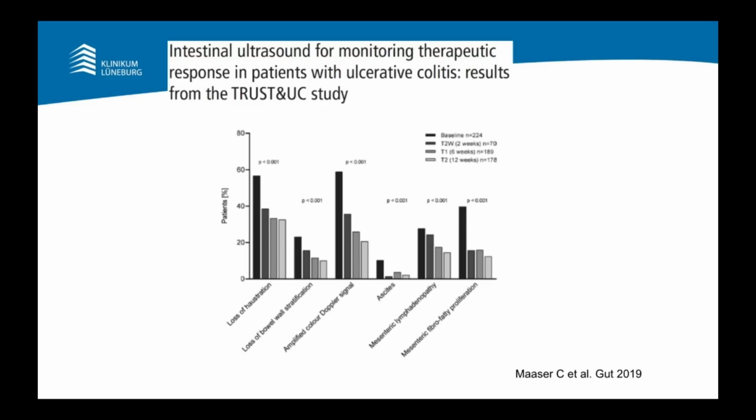So at a very early time point, you can actually follow up patients where you perform anti-inflammatory therapy. You could never do an endoscopic follow-up at 2 weeks or even at 6 weeks, but with ultrasound you can see a very early response. Now future studies will have to detect this, looking at this early time, but you can really predict who is on the right medication, where you have to intensify medication, or where you could maybe at a very early time point already change the type of therapy.